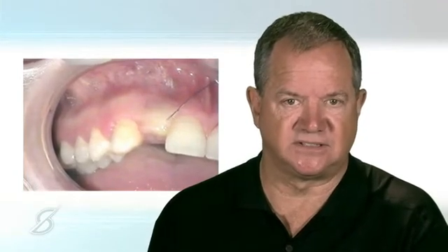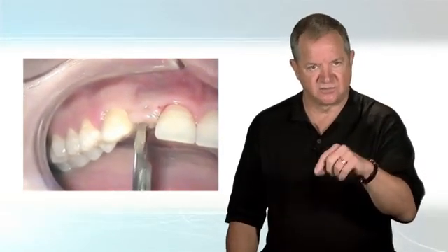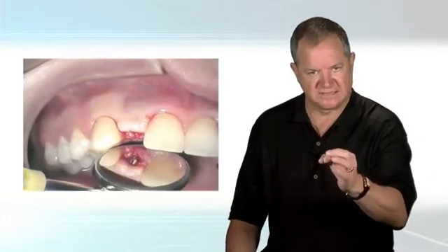And oftentimes when I get a case back that's been grafted significantly, the tissue may have actually even healed over the healing abutment. You can either use a scalpel or honestly a laser works great for this. You can't really use an electrosurge because you don't want to hit the implant. But a scalpel, just so you can gain access to the screw in the healing abutment, or just take your laser, and if you know where the implant is, just start working your way down in a circle until you can see, just as I did there. And now same thing, we put our impression coping in place, make sure it locks into the hex.